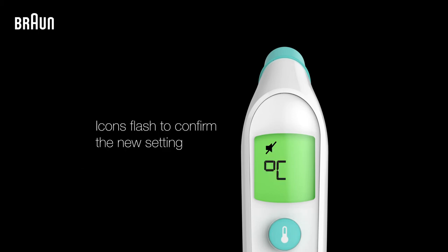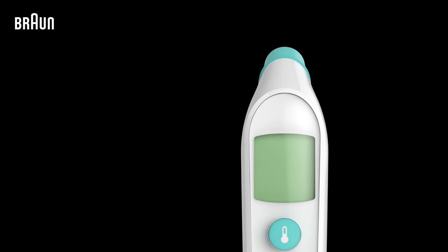The selected icons will flash on the screen to confirm the new setting. The thermometer will turn off automatically.